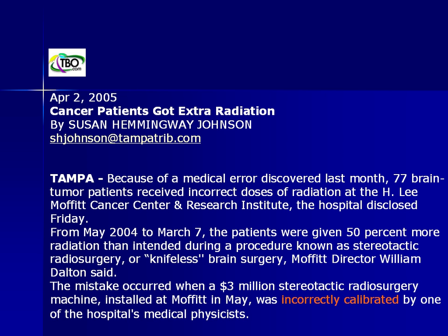So this actually could have gone on a bit longer, except that they had an RPC visit within the first year after treatment. So what didn't happen here, I think, were redundant checks of a newly calibrated machine, basically.